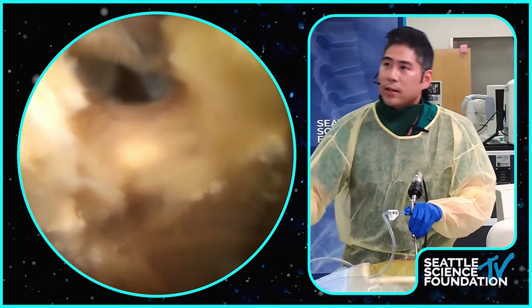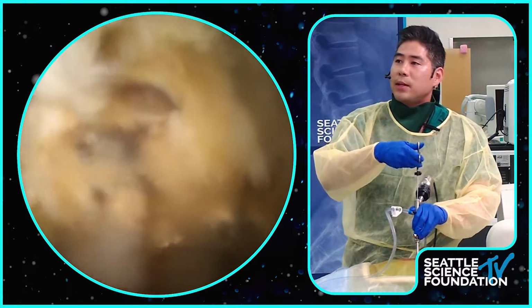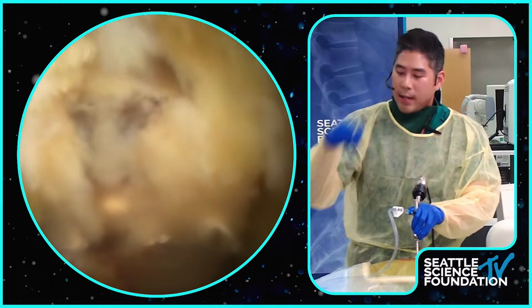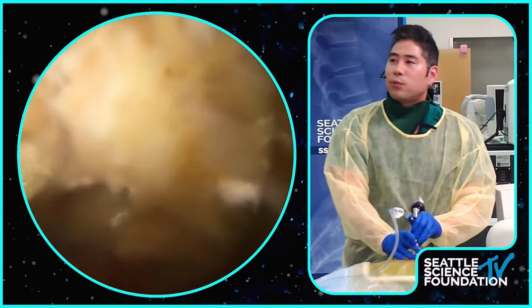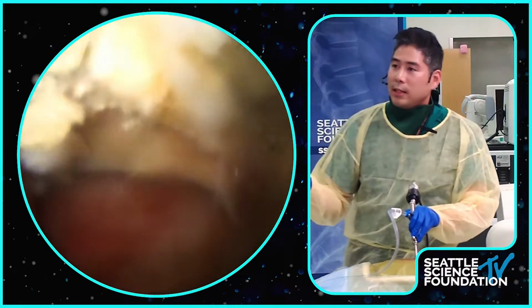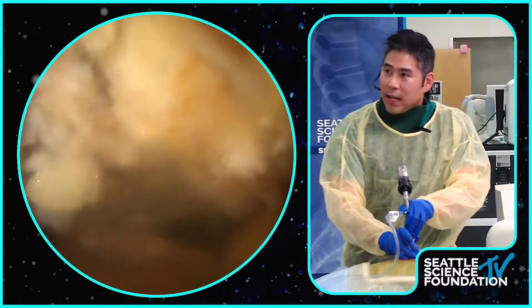And as you know, the yellow ligament actually has two layers, the deep and then the superficial layer. So I go by layer, and as I make the small holes, I'm actually putting more pressure on the tube. So I'm doing some blunt dissection. Bipolar, please. And let me see... okay, so that's the hole, okay?